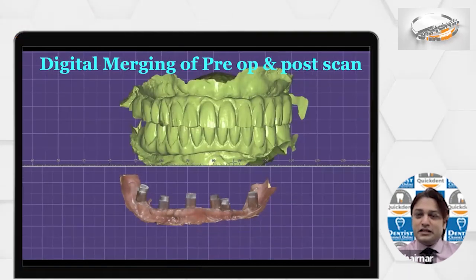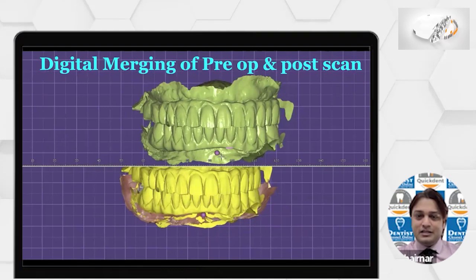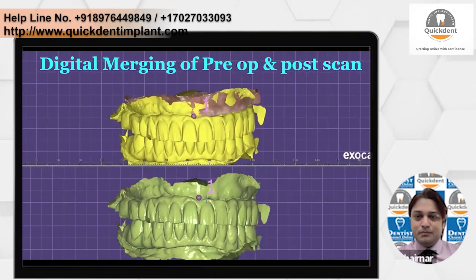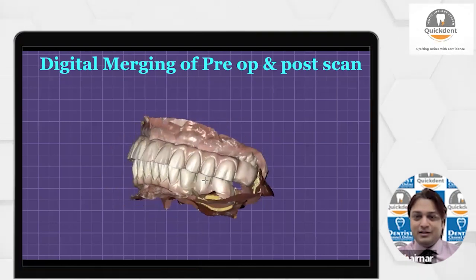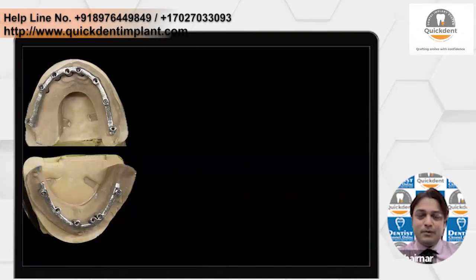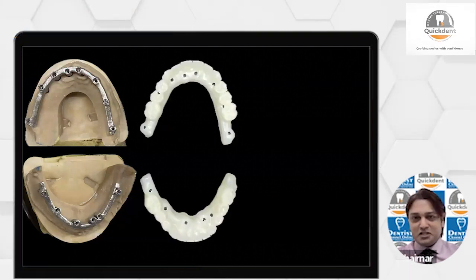Now we send this data to the technician, and this is how he will match these 2 data sets on the scan body, where the teeth are recorded. According to that, he will make a metal trial and again prepare a shell.